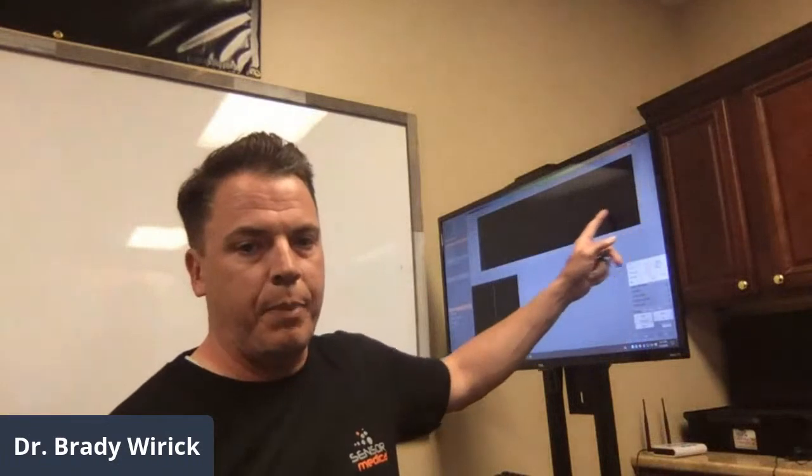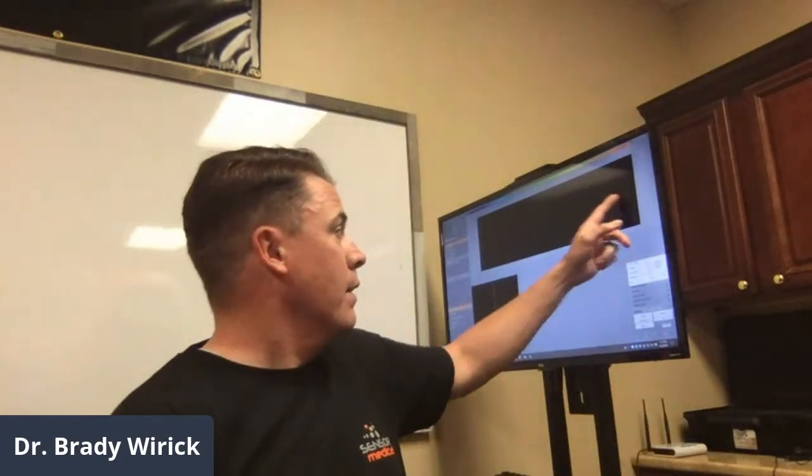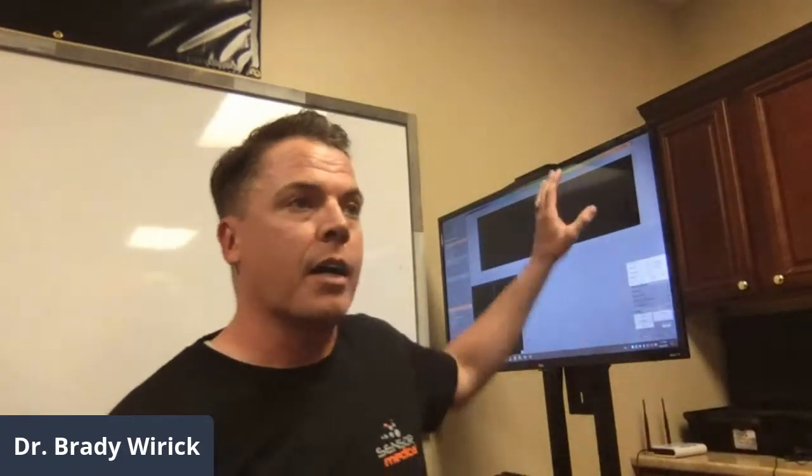Okay, awesome. So we are going to do this gait analysis, and what you're going to see is Pat's footsteps across the screen here. And then once we're done, I will talk about what those footsteps show us.